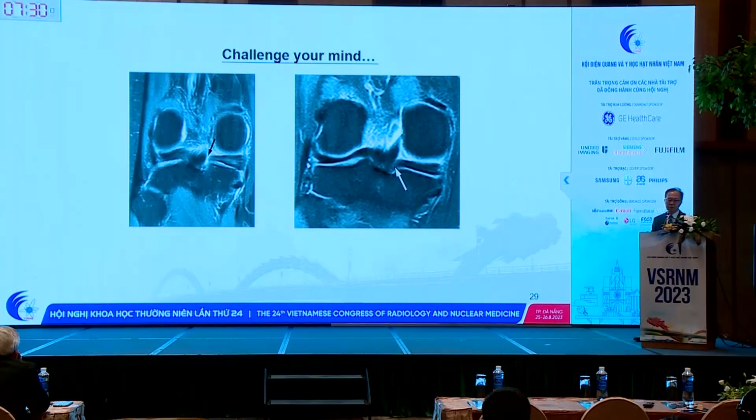So when an orthopedic surgeon argues with you, saying, okay, we can't see anything, your report has a meniscal fracture in the posterior horn, and in our scope, we see nothing. Yeah, you're making a joke. No, it is not a joke. It is a true meniscal fracture. It is a false negative by the scope. It is not a false positive by MR imaging.